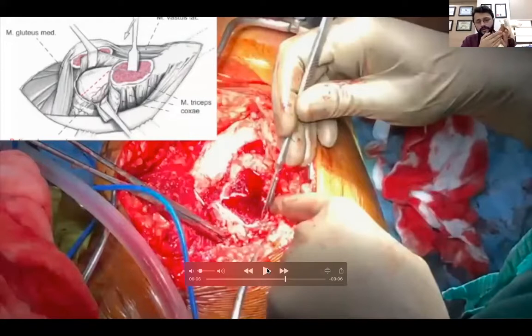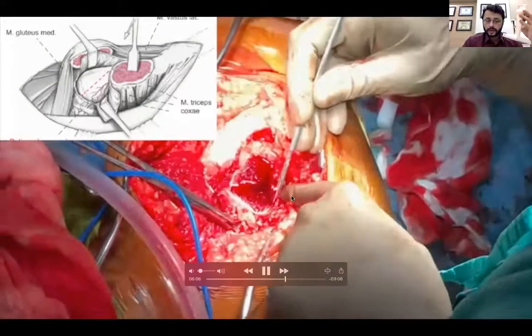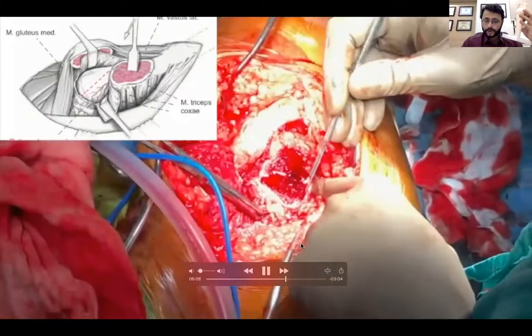So this entire metaphysis is devoid of periosteum once we have raised it. What is very important to know is that the entire capital femoral epiphysis is posterior. So when we want to reduce this hip, this posterior blood supply is not going to allow it unless we create some slack. That slack is going to be created by removing the top part of the entire bone here. Only then will that flap allow that much stretch so that the femoral head can sit anteriorly, right? So this is what I'm going to create. So I'm going to release all the retinacular flap off the top of the trochanter like this.